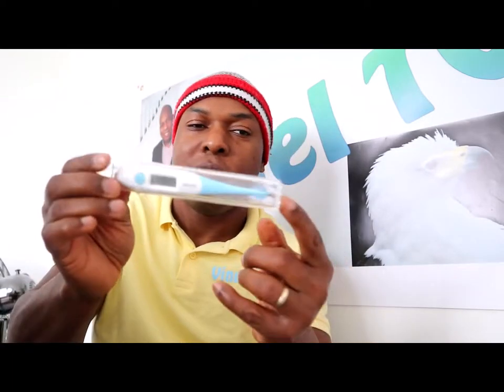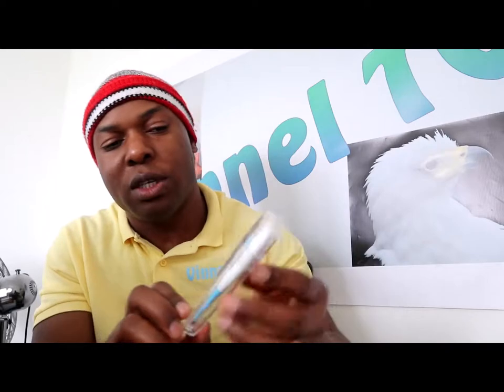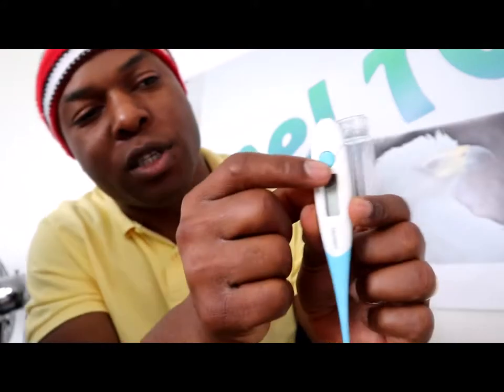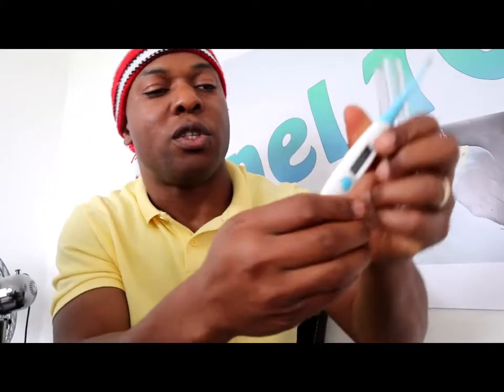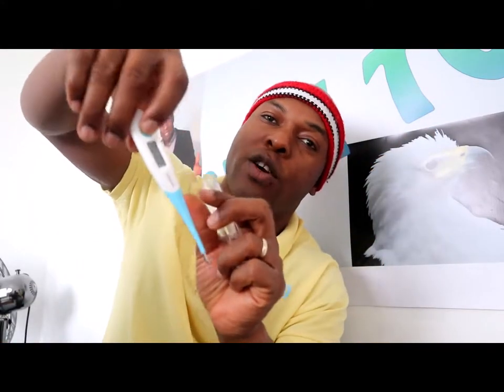You store this in a dry cupboard. You store this where it's not moist, in a dry environment. So this is a thermometer probe. I just showed you how to use this. You put it on and off with this button here. Okay, on and off button. You turn it off, press it on and off.